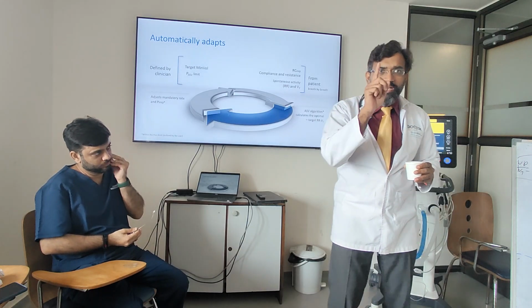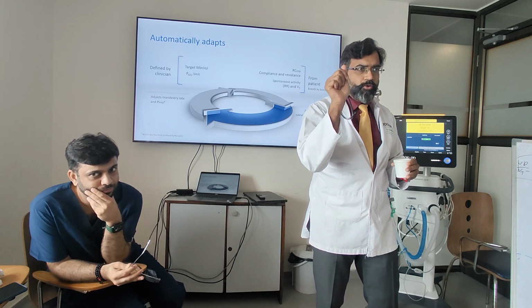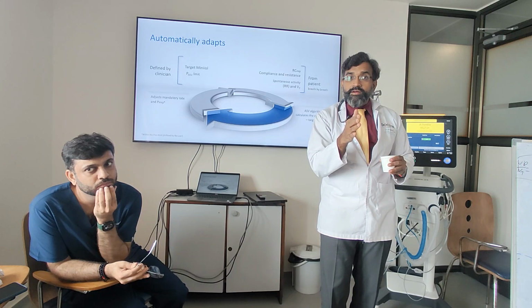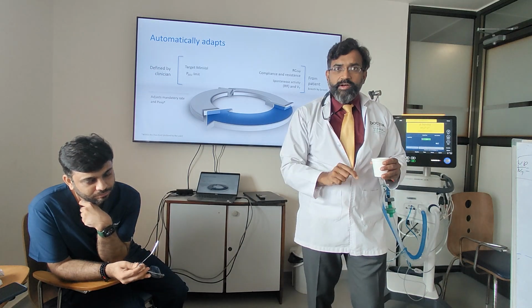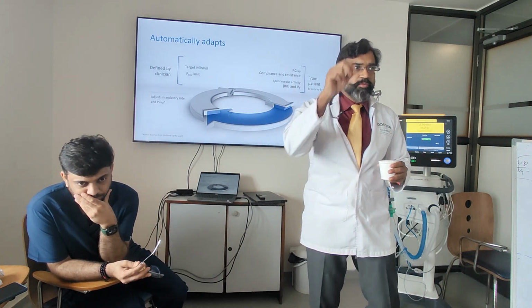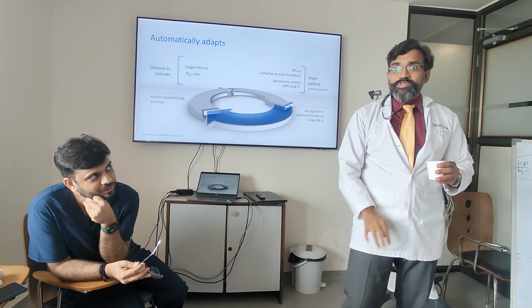Let's take the example of any patient in the ICU. You have set volume control, and the RR is 20. For that many breaths, the same volume is given. Exactly. If you have set a tidal volume of 500, every breath will be 500 ml, irrespective of the rate, so the patient has a chance of going into respiratory alkalosis.